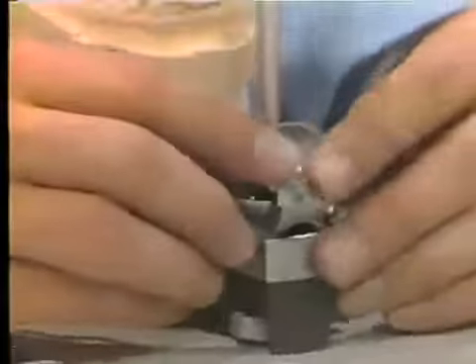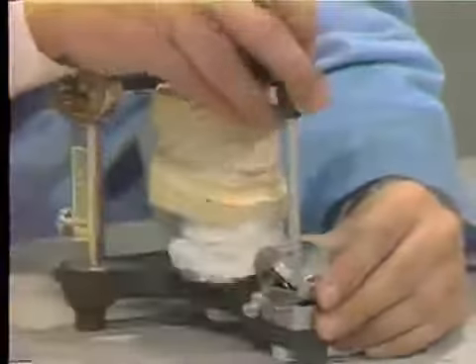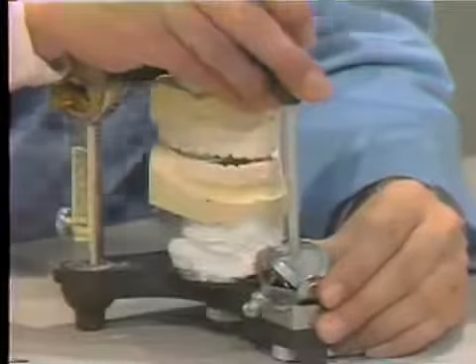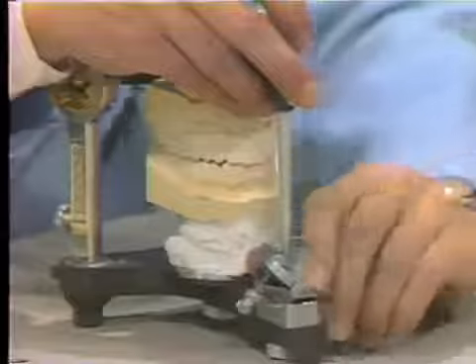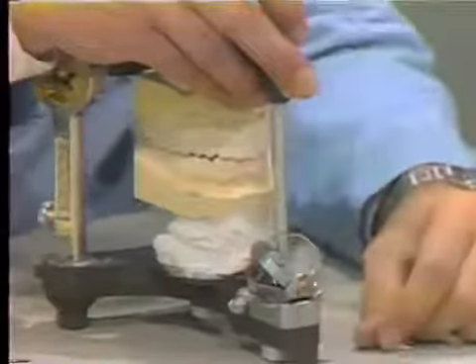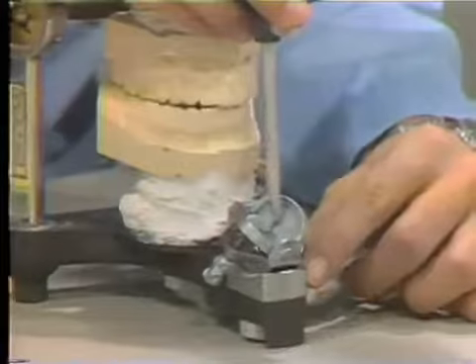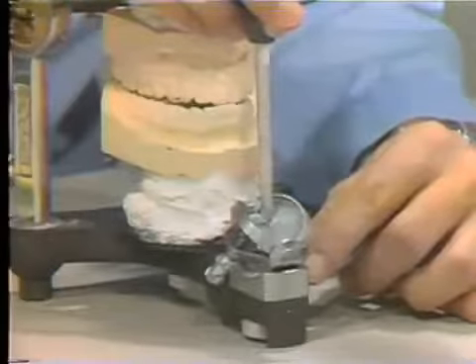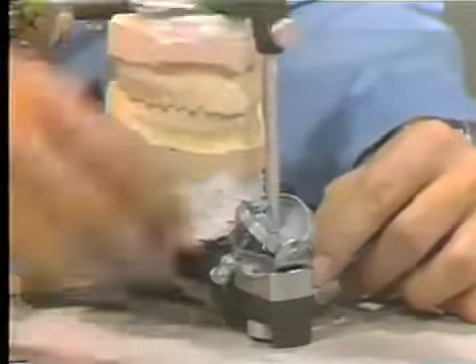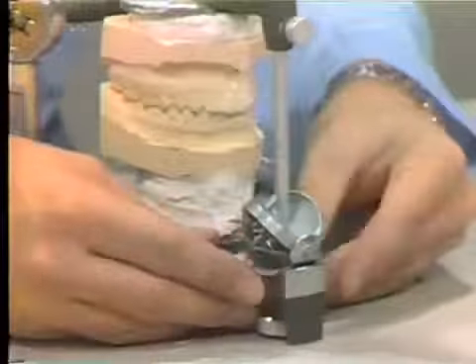However, if I attempt to set the protrusive inclination by simulating a protrusive excursion of the cast, bringing them into a near end-to-end relationship, this incisal table does not raise far enough to allow the pin to come into contact with the table. So at this stage, the stone casts are abrading. And to prevent this abrasion, we're going to fabricate the customized incisal guide.